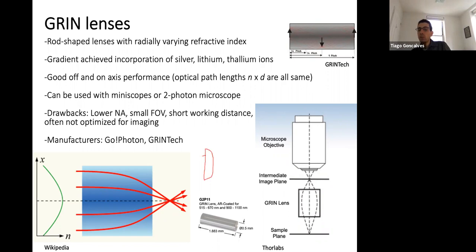And there's ways to mitigate this. We have a system in our microscope where we shine a little laser diode along the optic axis of the microscope. It's a little dot that is projected, and it's back reflected from the cover slip. And you project this back into a little camera, and then you can center this. You basically use a bullseye to align the animal very precisely with these micrometric screws.